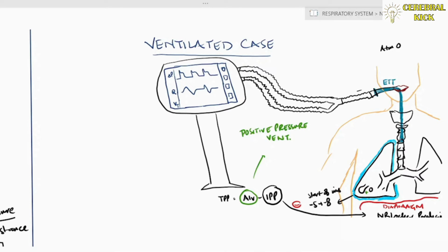The ventilator would increase the pressures greater than the alveolar pressure of 0, and due to this pressure gradient, flow would be established. So when flow is generated through the breathing circuit, ETT and airways, it would try to overcome the resistance. This is called the peak pressure, until the inspiration arrests.